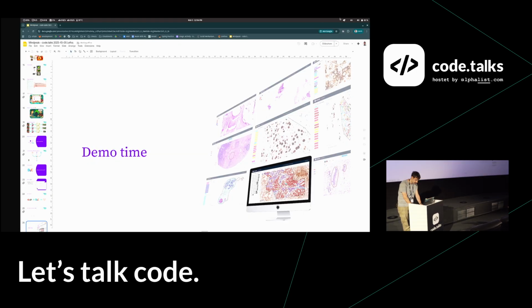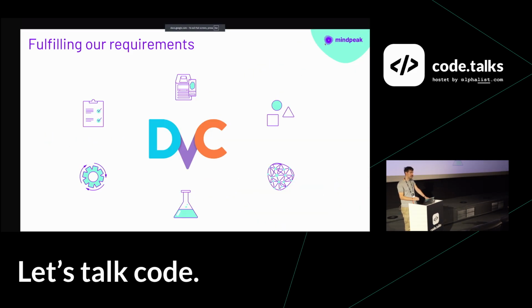So yeah, this was the demo. Just a really small recap. We wanted a tool to track our data and our annotations. We have this. We want a tool to track our methods, our code, our architectures. We have this. We want something that enables us to have an experiment registry. We have this. We also want something that doesn't hinder us, but gives us fast iterations. I think we also have this with this pipeline. And we want something that makes regulatory happy, because if I release a model, I can really tell how I trained it in the end.